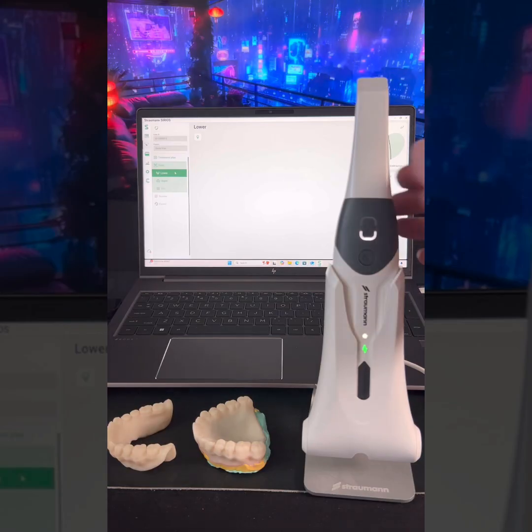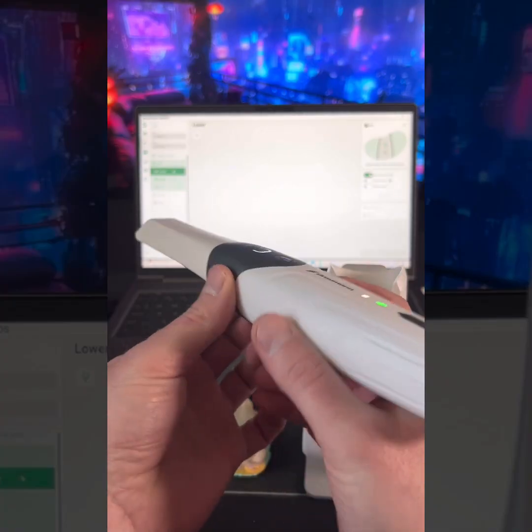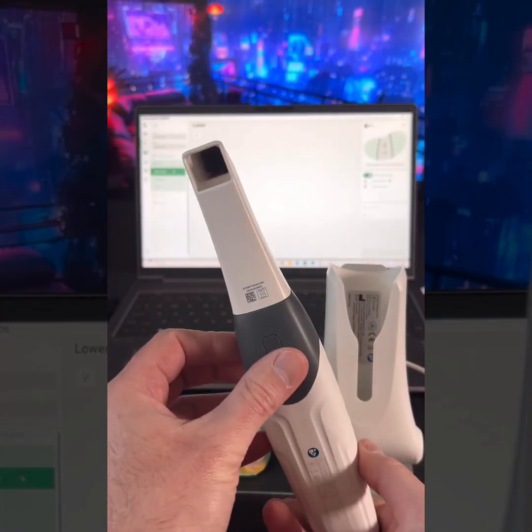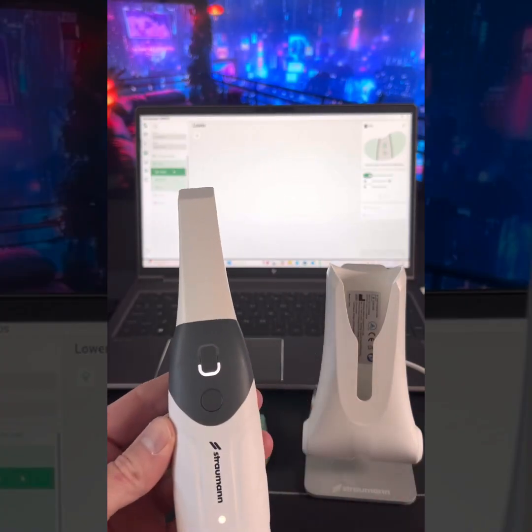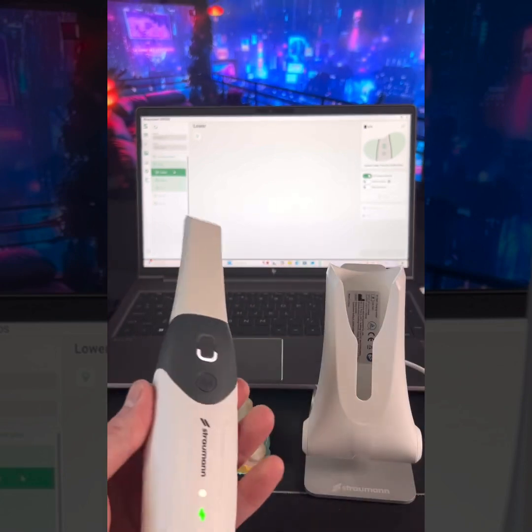So this is the Sirius scanner. It's all cordless. It's pretty nice and light — you can hold it however way you normally do it. This is the large tip I'm going to be using for the denture, but we also have a small tip, and you can kind of see the different sizes here. Let's get cracking.